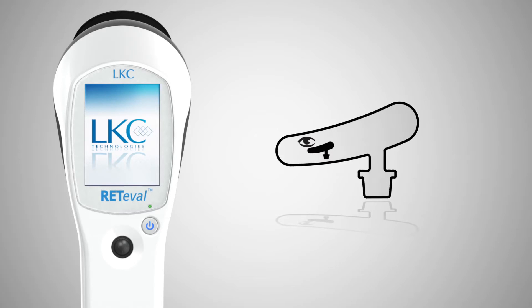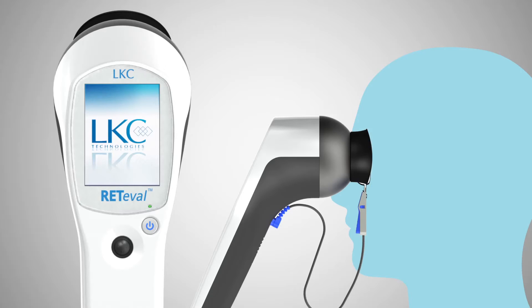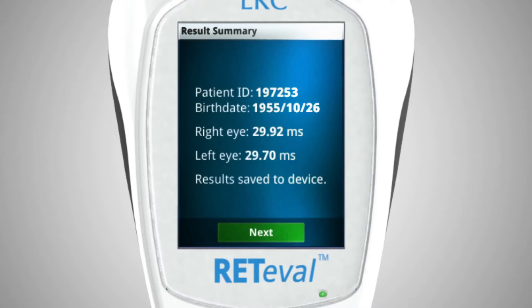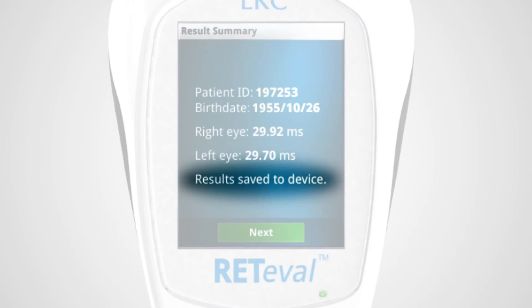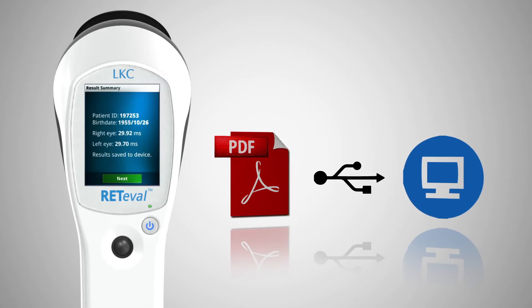Features of Reteval include unique patent-pending sensor strips that streamline the setup process, auto adjustment of flash intensity based on pupil size eliminating the need to dilate the eye, multilingual support, the ability to store results on the device for later review, and the ability to transfer results in PDF format to any computer via a standard USB connection.